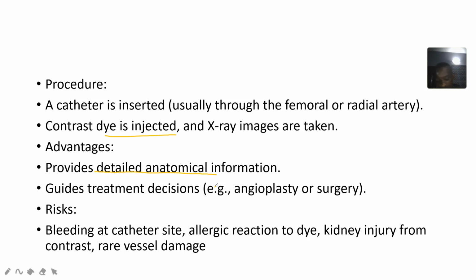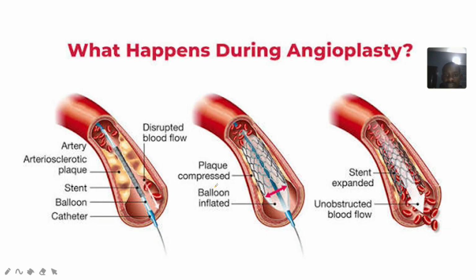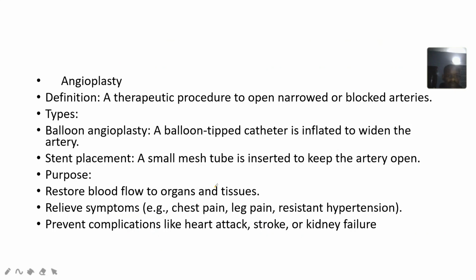Bleeding is common, and sometimes the patient could react to the dye you put, so you have to always make sure that they are not allergic to it. And there are kidney injuries, if the dye stresses the kidneys too much.